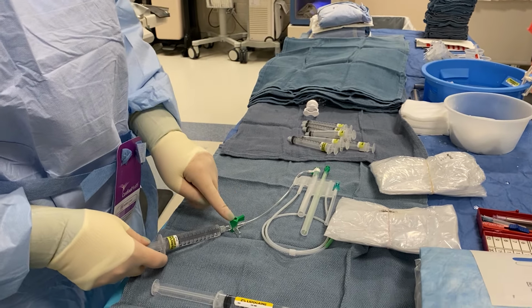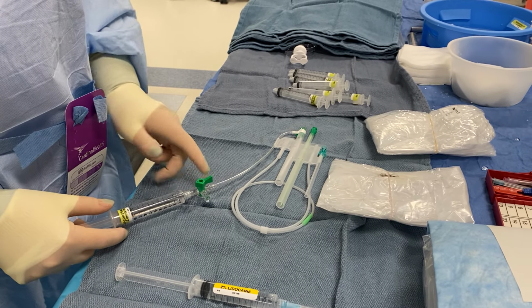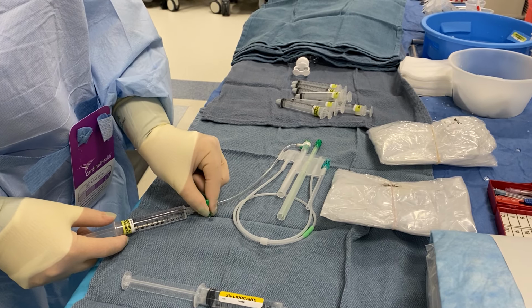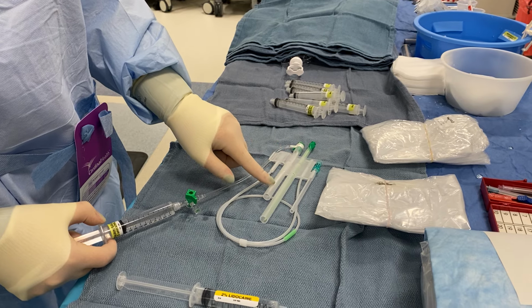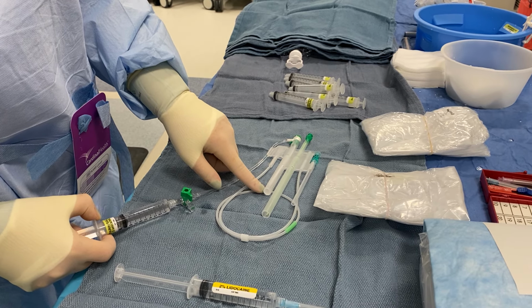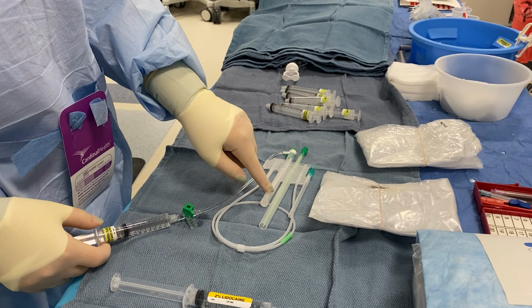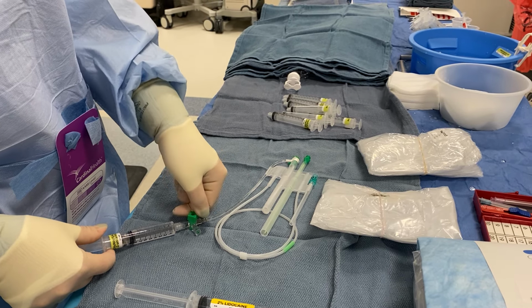And I wanna flush everything. So I wanna flush out this port that way. And then in order to flush down the line, I need to turn this stopcock this way. So I'm gonna flush the line. It's gonna connect the sheath, and our saline's gonna come out this way. And now we know we're fully flushed. And then because I wanna close it to make sure that the patient doesn't bleed out of it later once we put it in, I'm gonna turn our stopcock to close it.